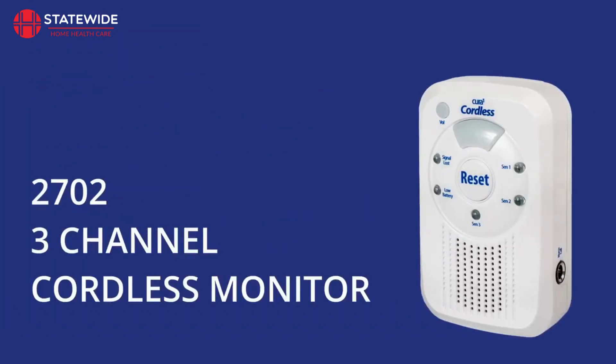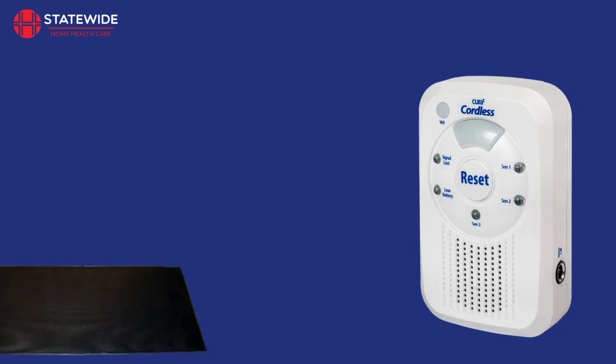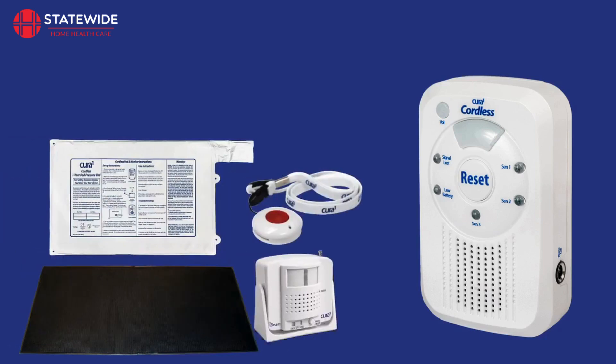The 2702 3-channel cordless falls monitor has an easy-to-read display with 6 LED indicators. It is a versatile tool for a caregiver in either a facility or home care environment. The 3-channel monitor works directly with Cura 1 mats, pads, buttons and sensors.